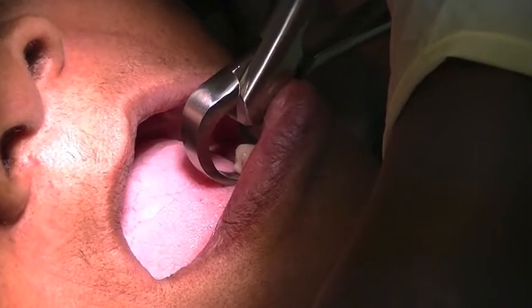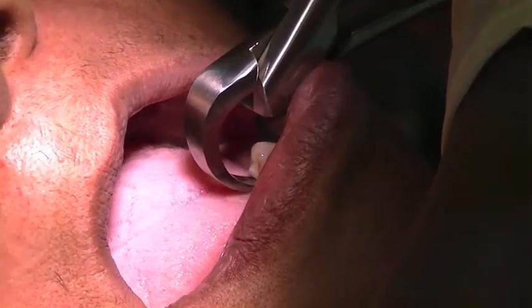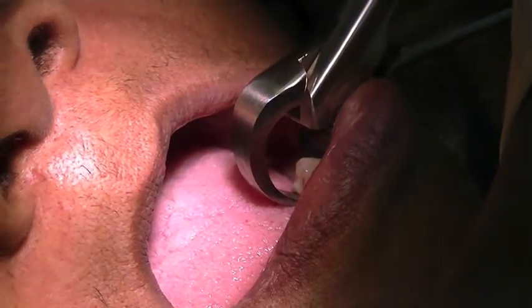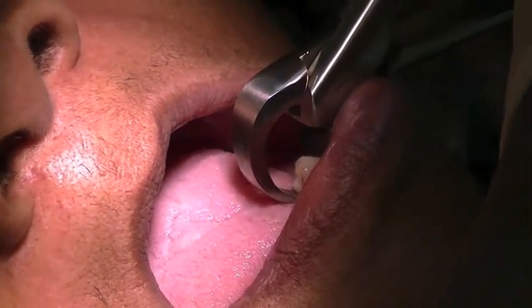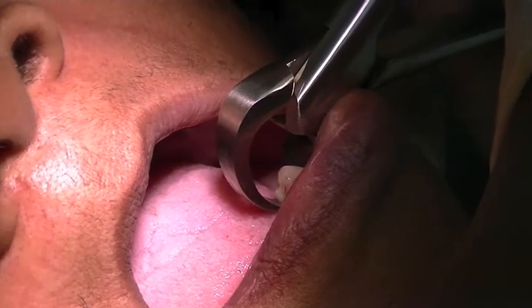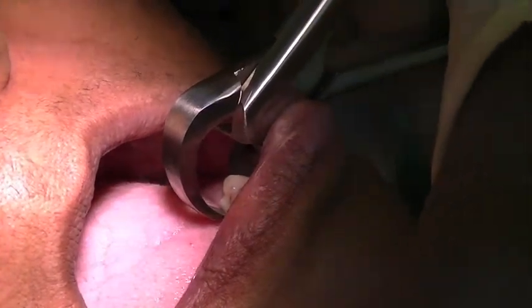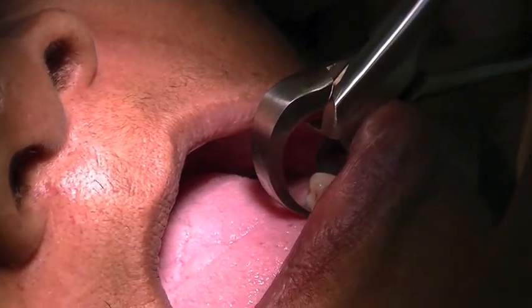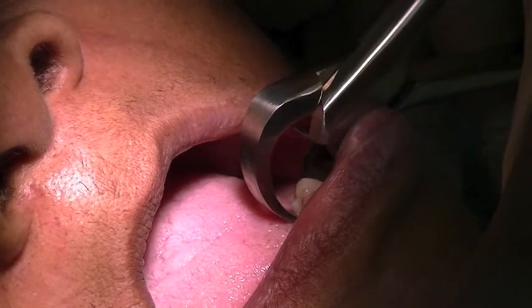This is the part where you just have to sit there and wait. Allow the energy to build up in the tooth, and you will see the tooth move. Once the tooth has moved, pick up a universal. It's already moved. We're looking probably for about 1 millimeter.